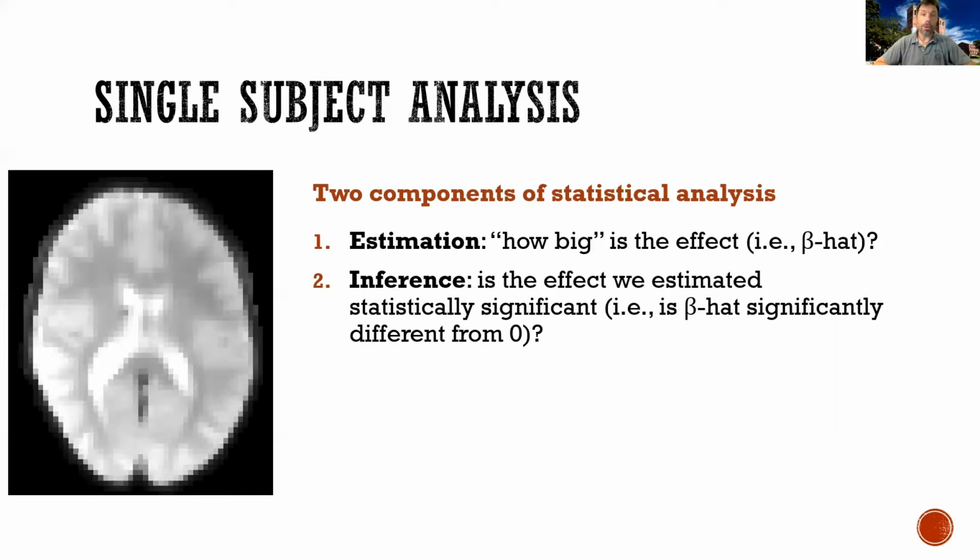Or maybe you could run a regression first on every single voxel, and then not even do an inference on a single voxel, but do a multivariate inference where you look at the pattern of voxels within certain areas. Okay, so I make this distinction so that you can keep in mind that you can use multiple strategies for the analysis, not just a conventional approach.